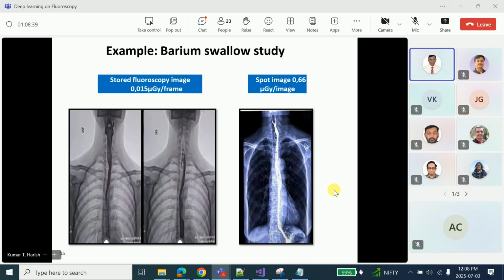It's like using a professional camera with all its features and lens, instead of an ordinary camera with a flash, to capture an image of that kind of quality. So it all depends on what you want to see. Your features and specifications are there, and how you want to see. But you will be adding to the dose to the patient.